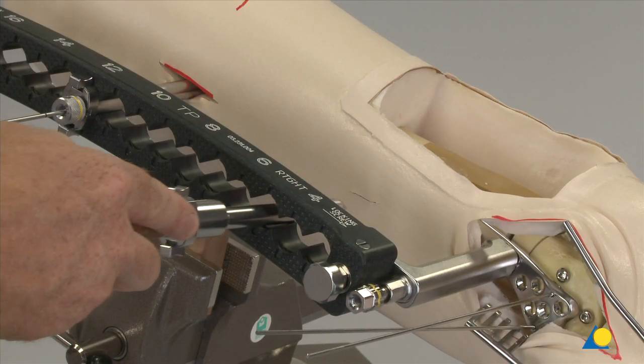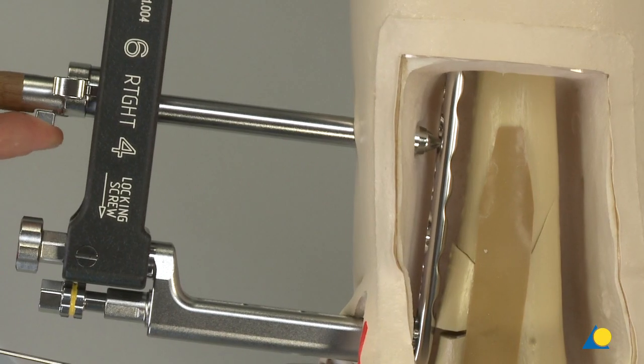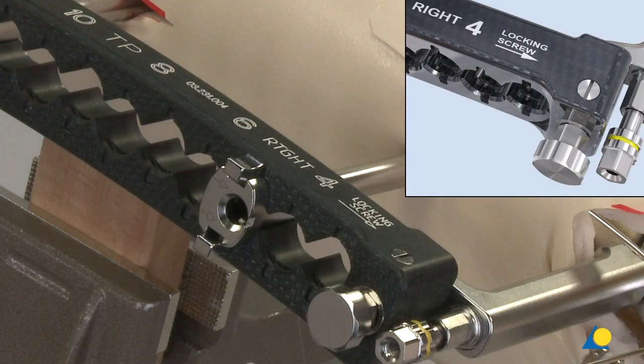The trocar and guide sleeve are slid through the aiming arm and the incision down to the plate. Remove the trocar. Ensure the arrow on the guide sleeve is in the direction of the locking screw arrow on the aiming arm.